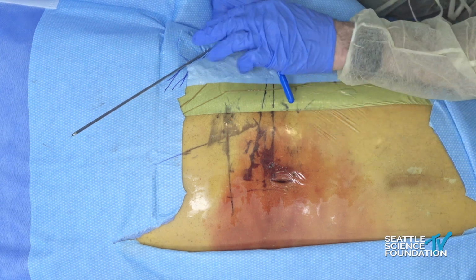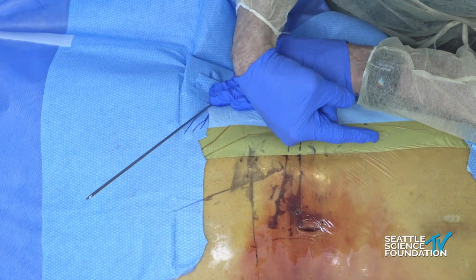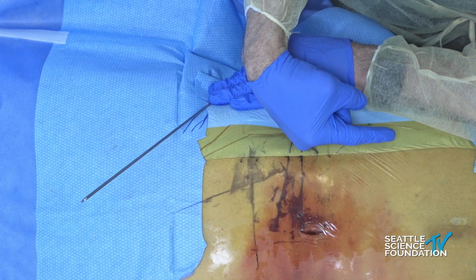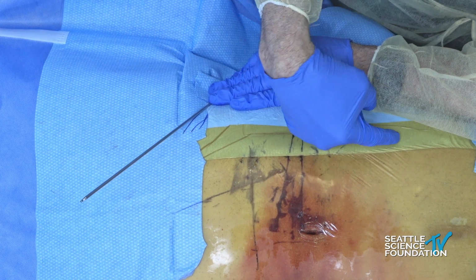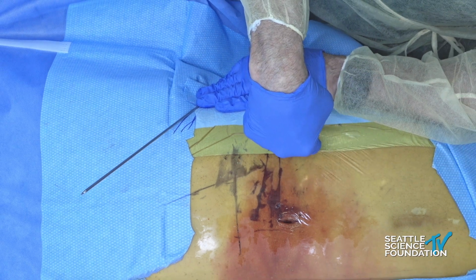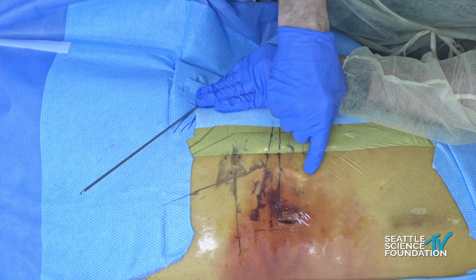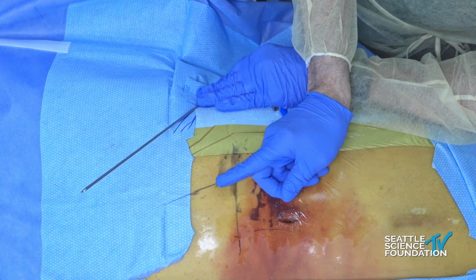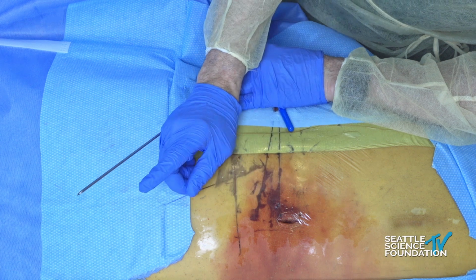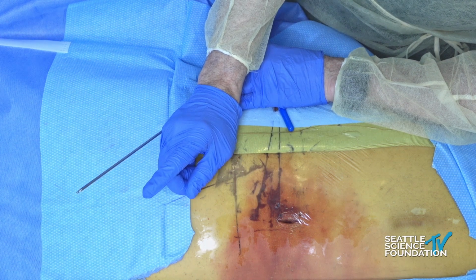I'd like to point out that superior on the cadaver is this, superior on the SI joint is this, right? So projecting like that. Inferior on the cadaver is this way. Inferior on the SI joint and the sacrum is this way. So we have to normalize it.